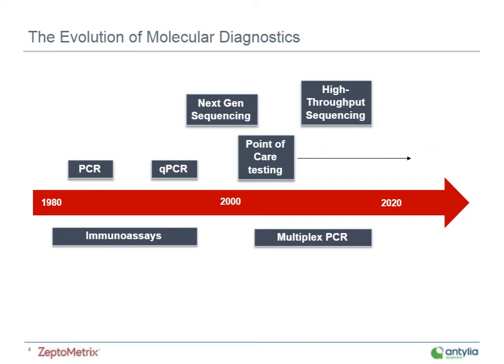And around the same time, DNA amplification methods were being honed. And HSV, I think, in cerebral spinal fluid was one of the first. And around this time, also, the first FDA-approved molecular diagnostic testing kit was released for the detection of chlamydia trachomatis. Of course, along with these, immunoassays were also being developed in tandem.